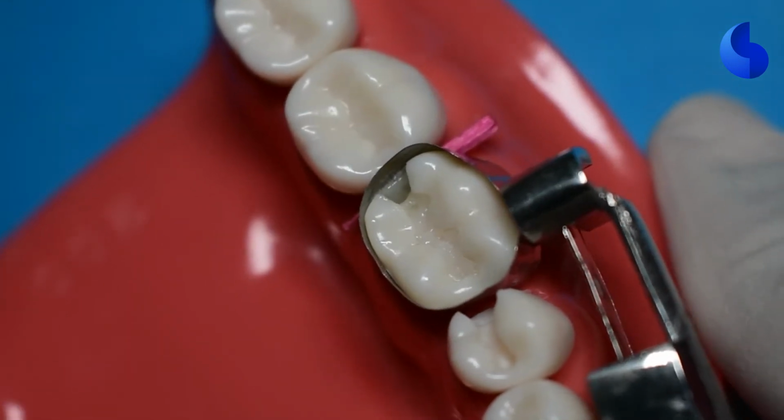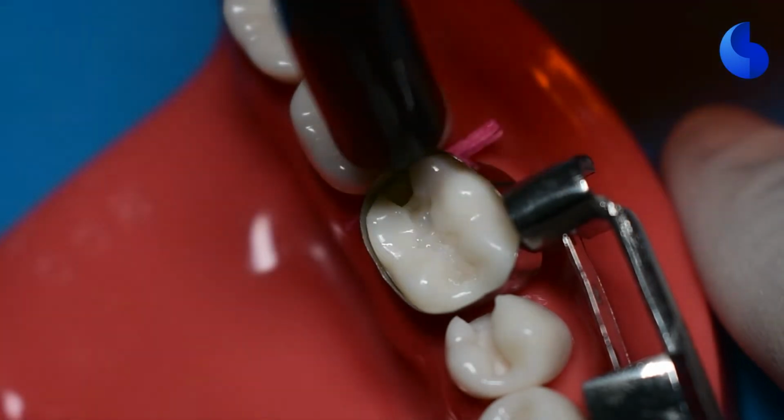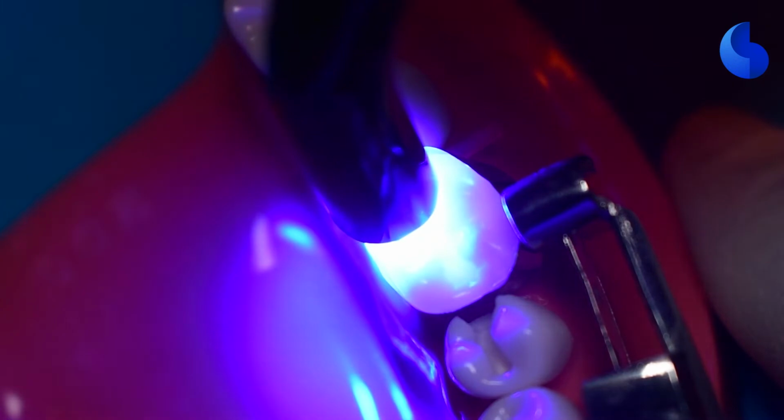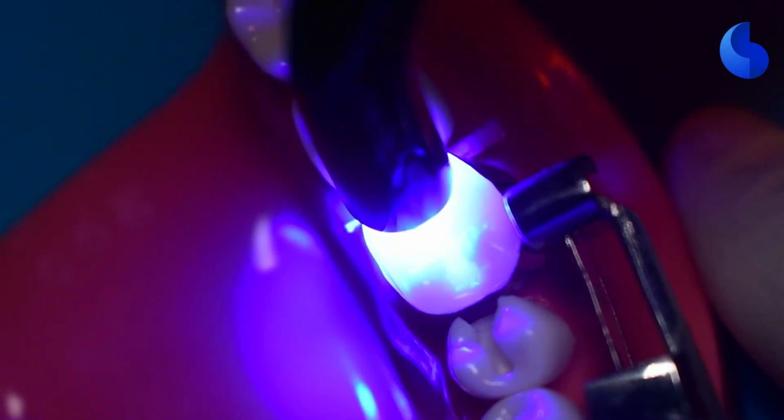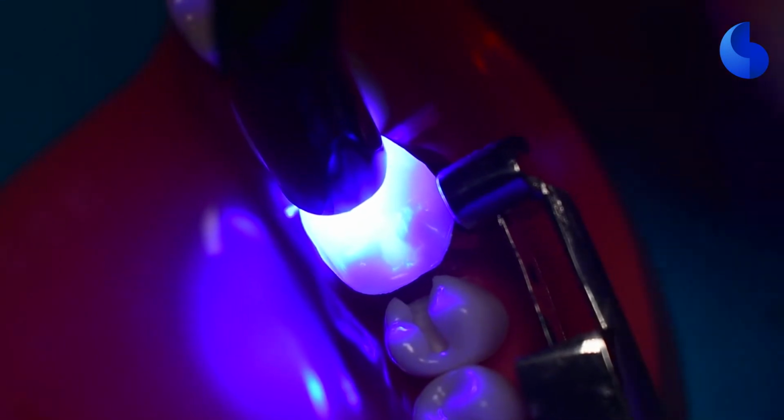And then you can use a sharp tip of an explorer to remove any excess composite that's flowed over between the matrix band and the buccal of the proximal walls, which would be difficult to remove if you've already cured the material. Once you're done with that, go ahead and cure the material.